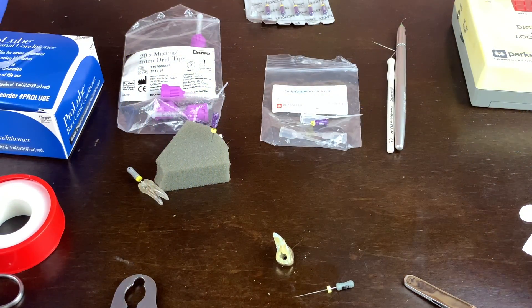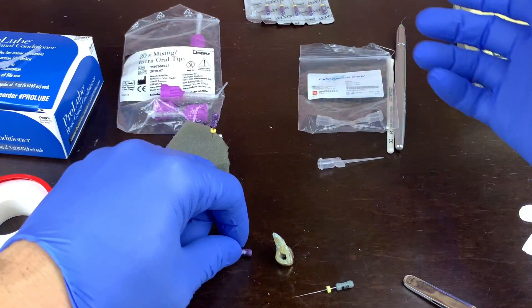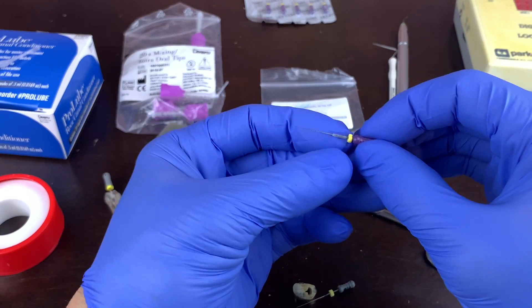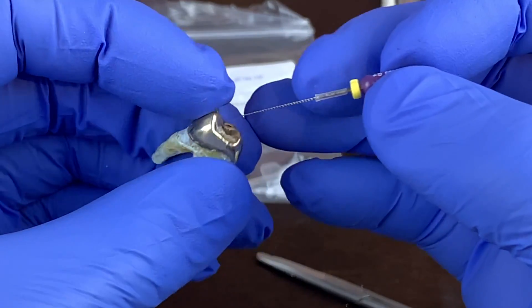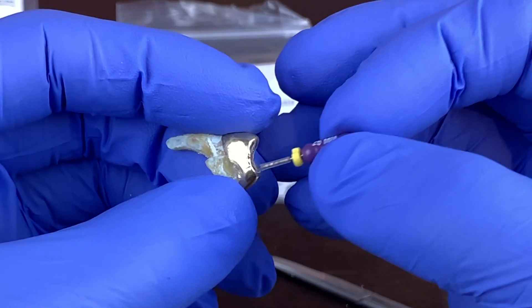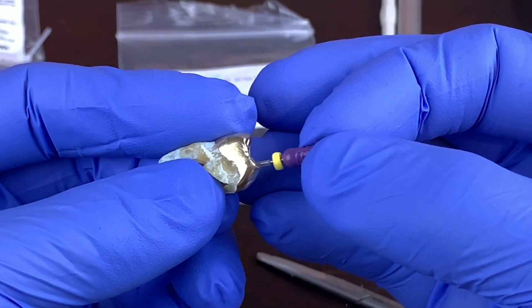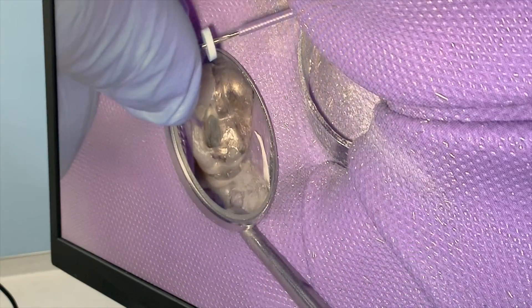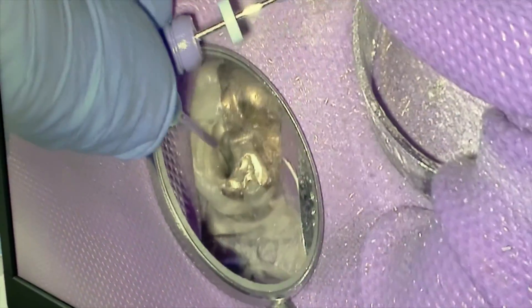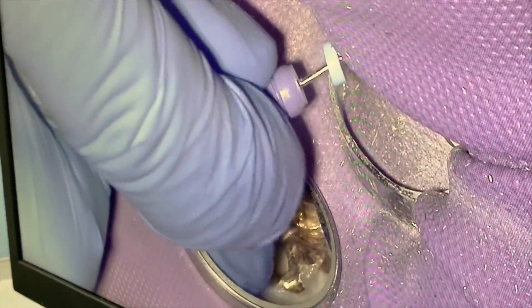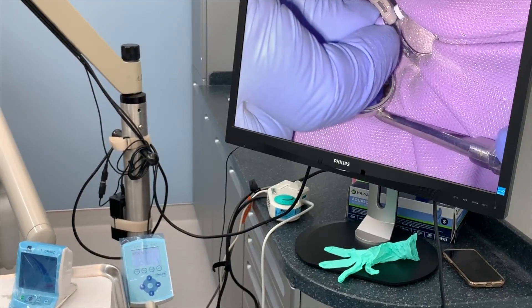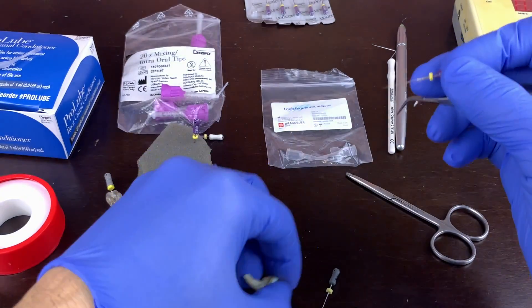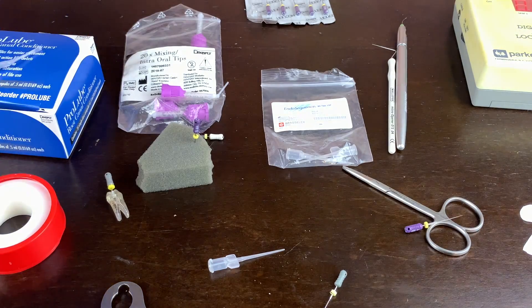So a couple other techniques work with using little insulating materials, clipping tips. So essentially, here's one here. I've clipped the end off. And what it does, essentially, it's going to place like an insulator. So we place our file in the canal and then this works, like in the live video I have right now. That goes on one of our root canal courses. And essentially, you can use any type of insulating material. Place your rubber stop to your working length. So we'll place this in here. We'll pretend that we're at working length and then voila, we're good to go. So there's a couple of different tips you can use.